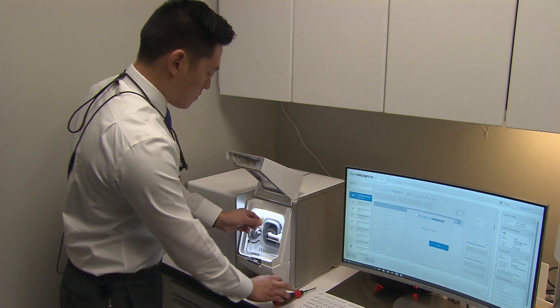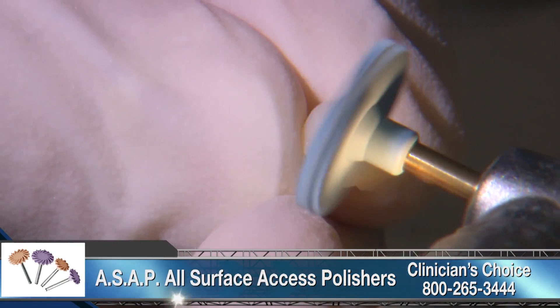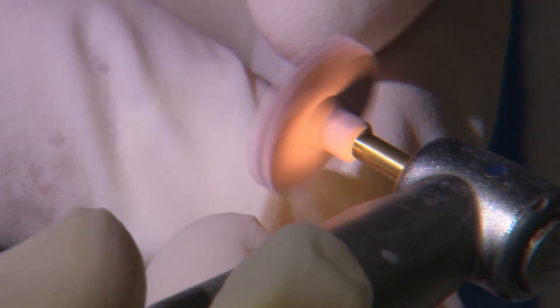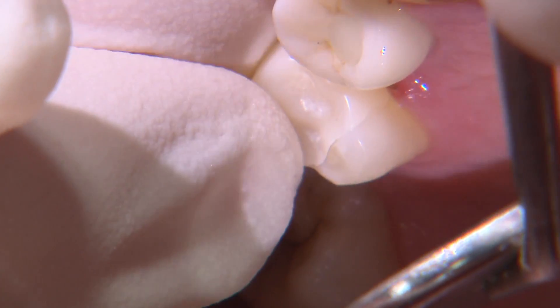Once the restoration is completed, I remove the sprue and polish the onlay using Clinician's Choice ASAP polishers. Once the restoration is checked for fit, this material needs to be properly treated prior to bonding.